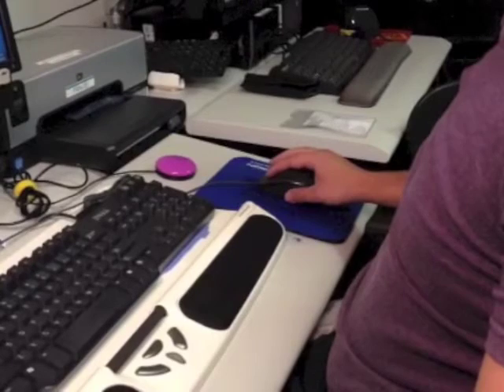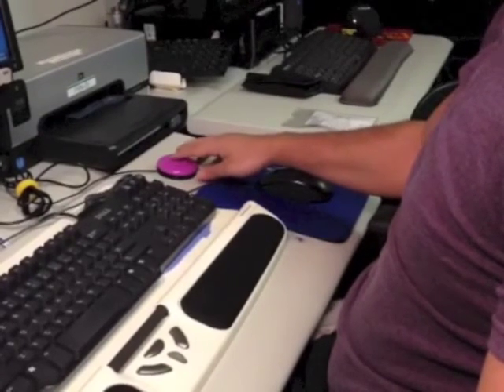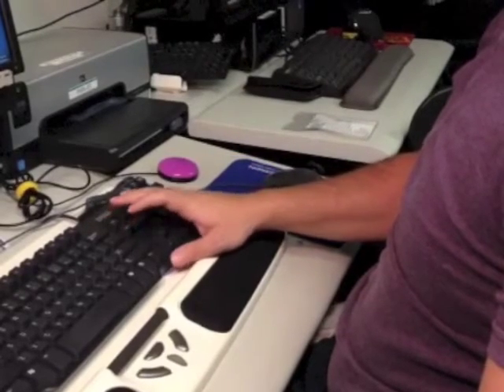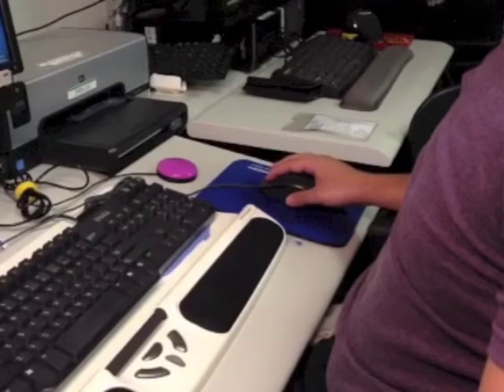You have a few options for clicking. You can use a regular mouse, any other type of switch input, a hot key like the enter key, voice command, a foot switch, or dwell click, which we will now demonstrate.